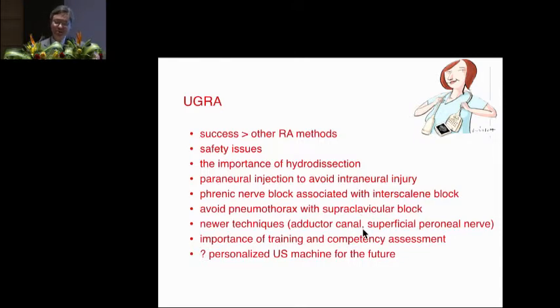Some of the newer techniques that we are learning to do, adductor canal block is simple to do. Superficial peroneal block is also simple. And emphasize training and how to assess competency, particularly if you are a teacher, you want to put emphasis on that. And hopefully, in the future, we all have our own ultrasound machine for different purposes.